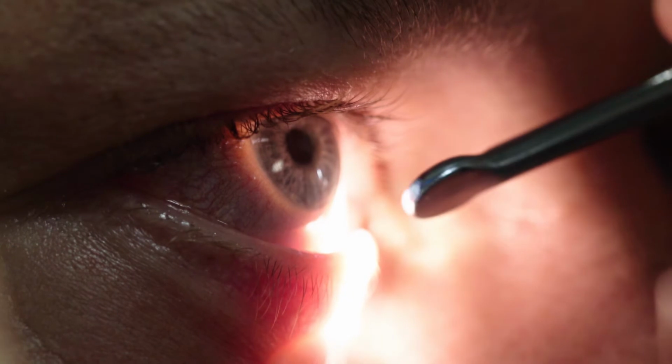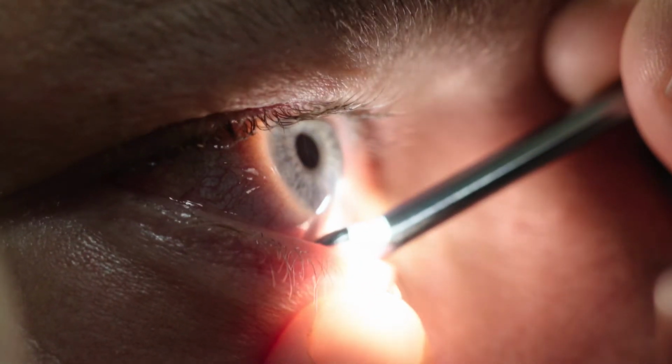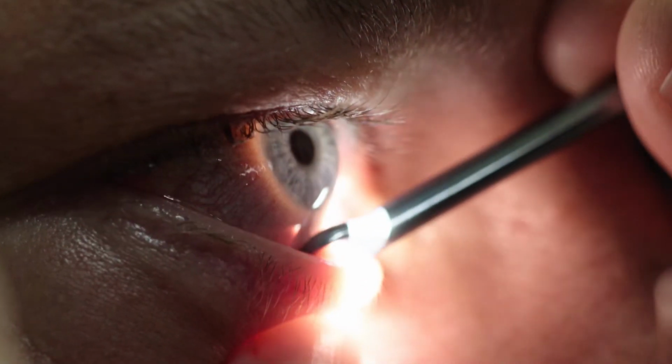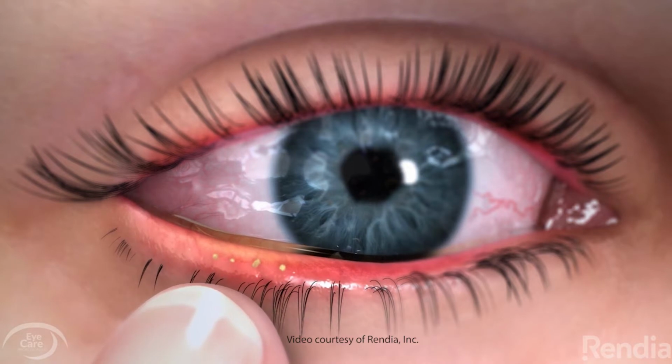Next, the expression. Various expression tools are available, like the Mistrata paddle, but even a fancy Q-tip works nicely. I like to express the center and nasal glands as they are the easiest to express. Evaluate how much is being expressed and the consistency of what is expressed. If low or thickened expressions, like toothpaste, we have a problem.